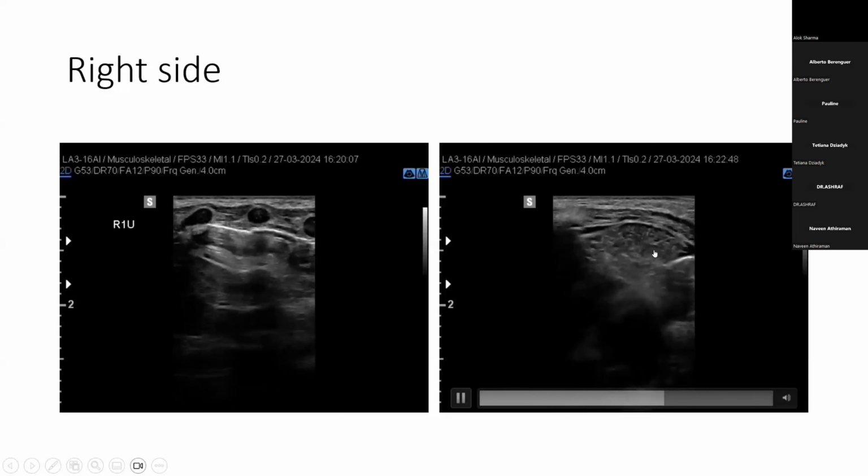And if I went to the anterior axillary line, I here saw, for me, a thymus. With more axillary here, a lung, and on the other part also, for me, lung tissue.